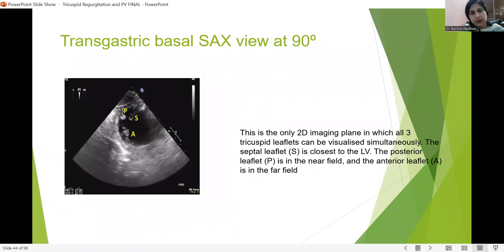The transgastric short axis view is the only view where we can see all three cusps of the tricuspid valve simultaneously.